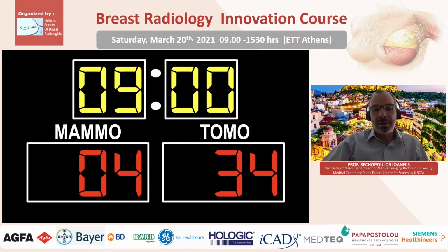If we have slabs every 3 millimeters, the number of images goes down by a factor of 3. So now we're already at a comparison on an average case of 34 images to be read instead of 204. So we're getting closer.